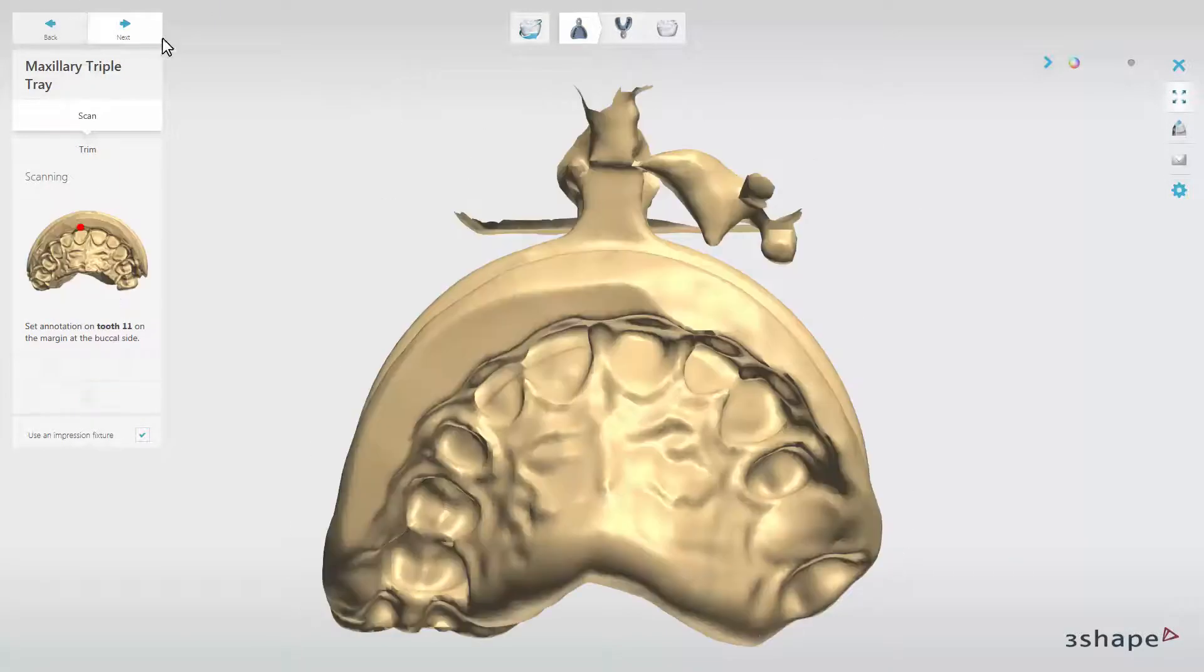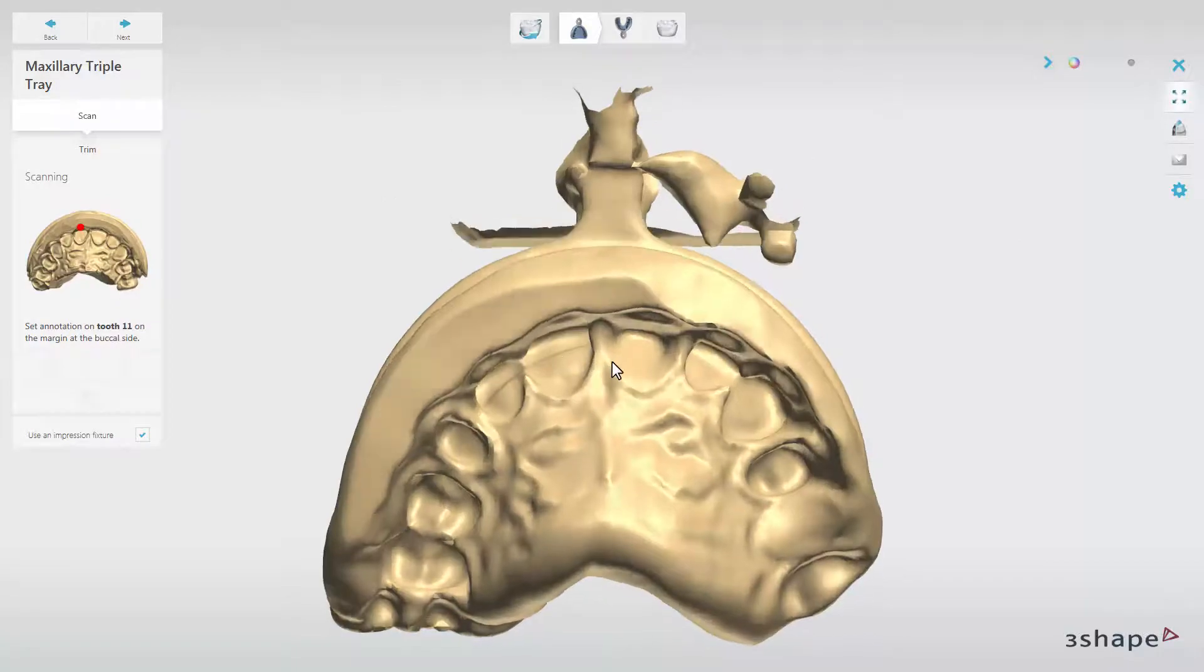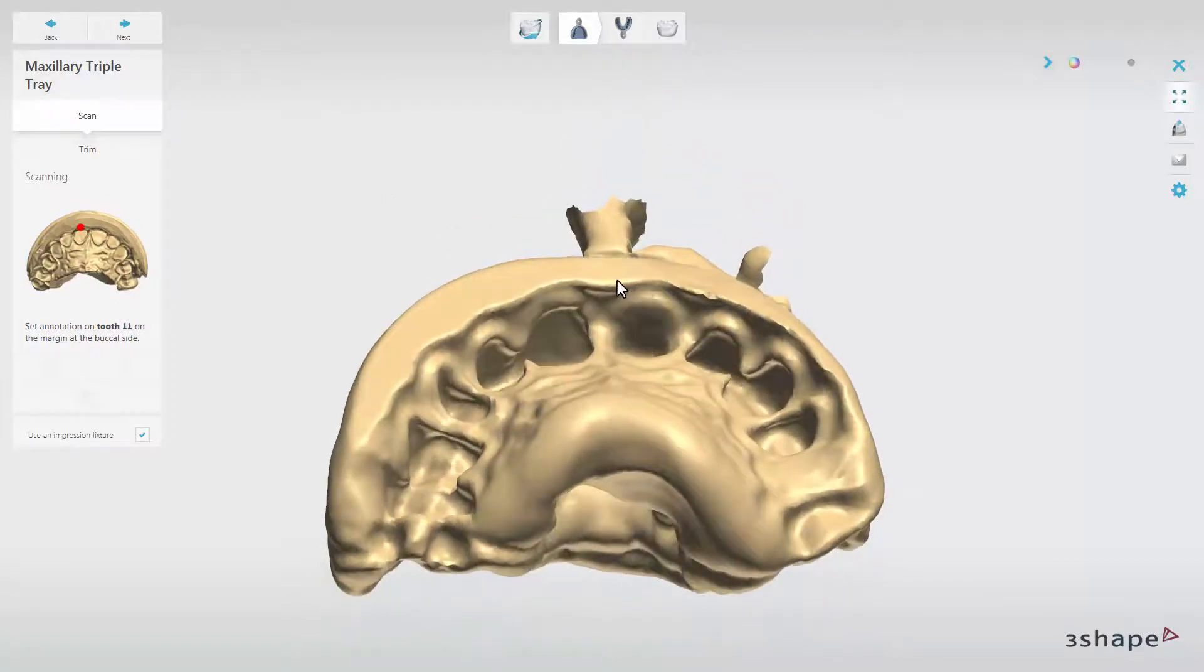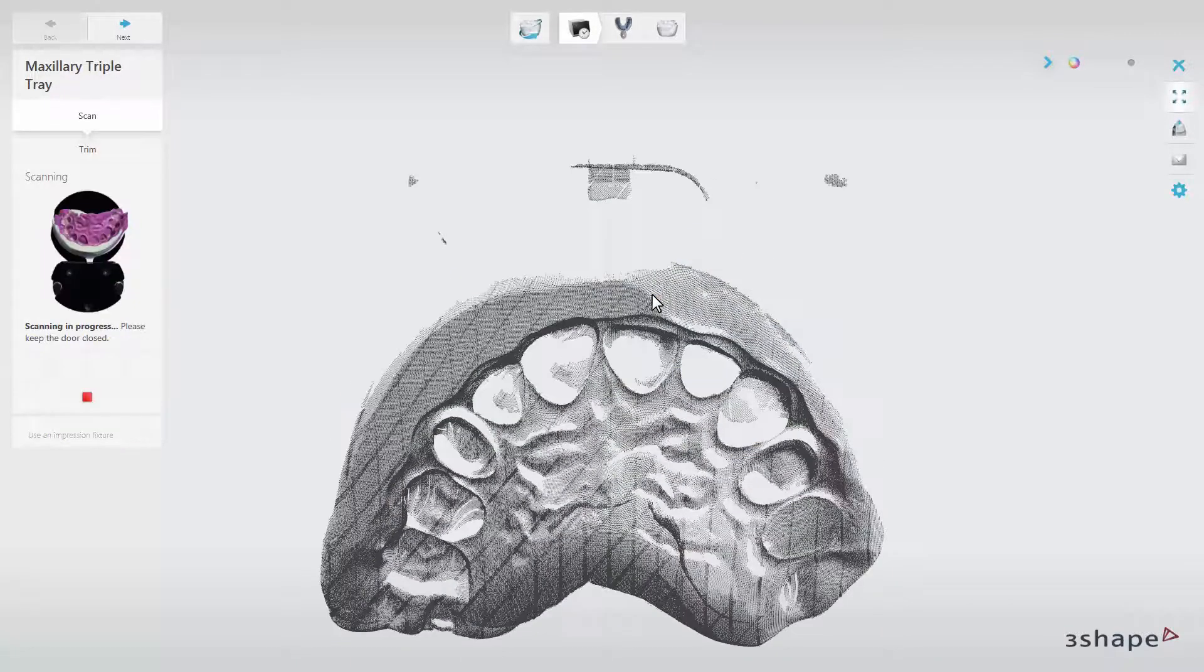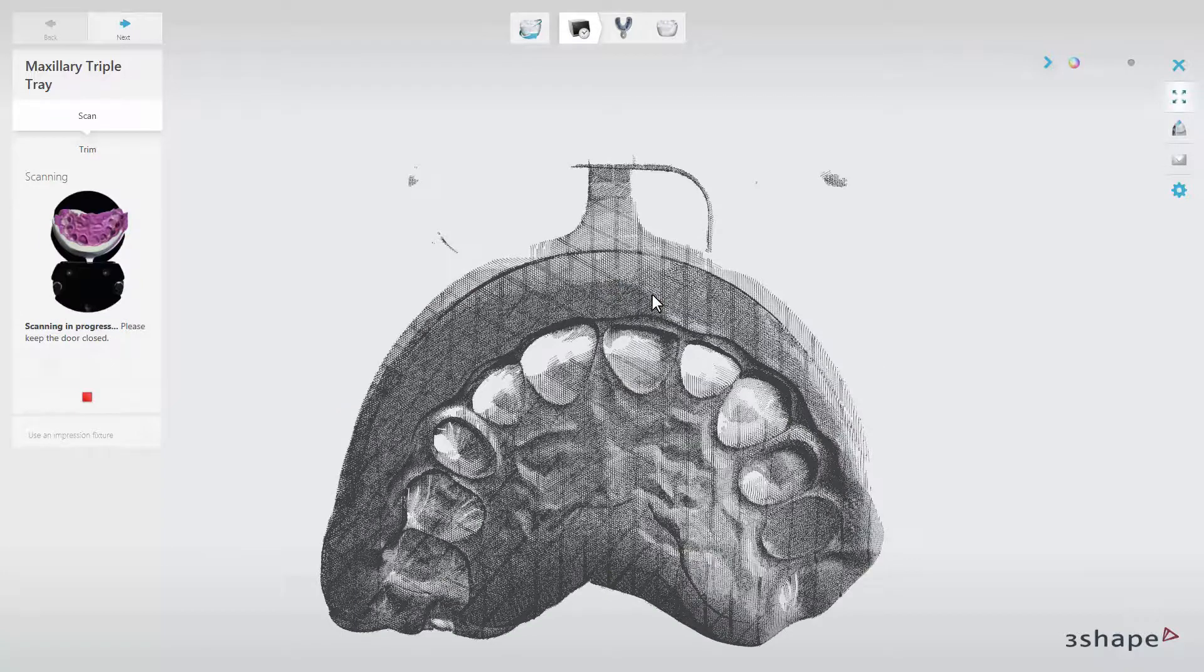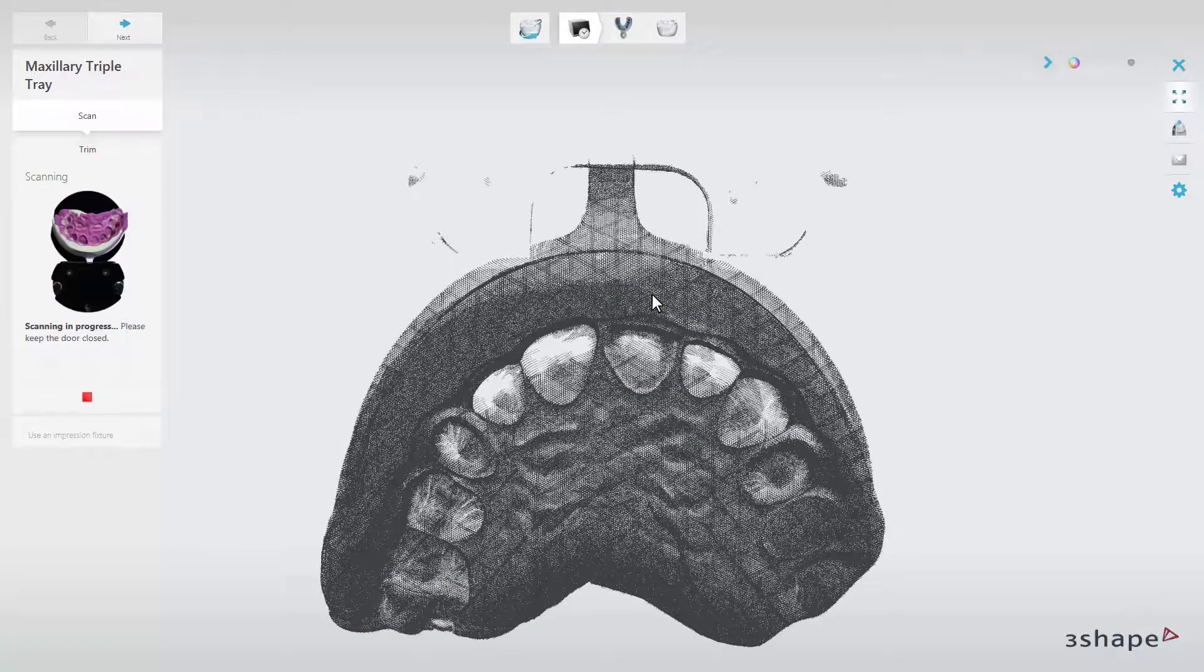The scanner will first make an initial scan, on which you should place annotations. Once done, the scanner will automatically start detailed scanning.